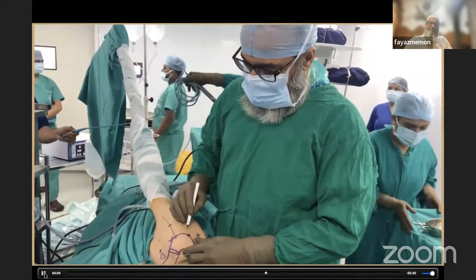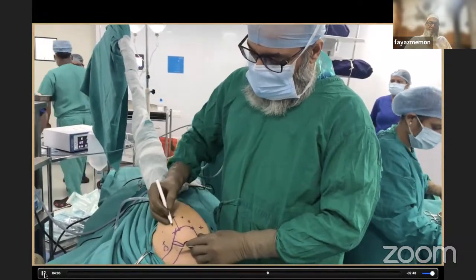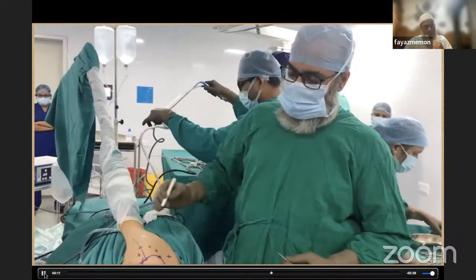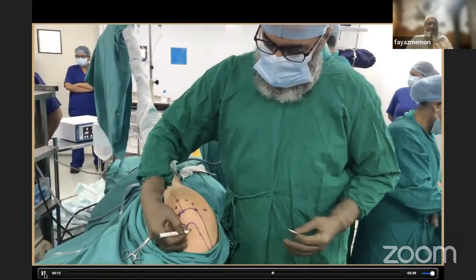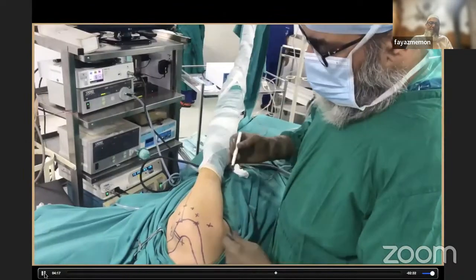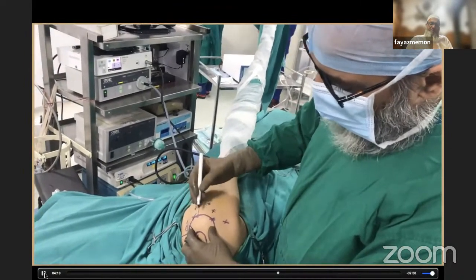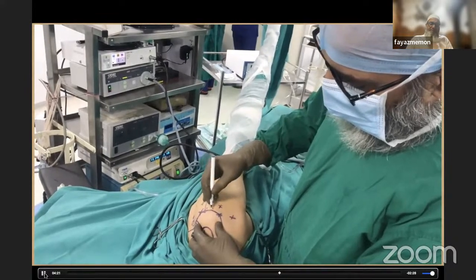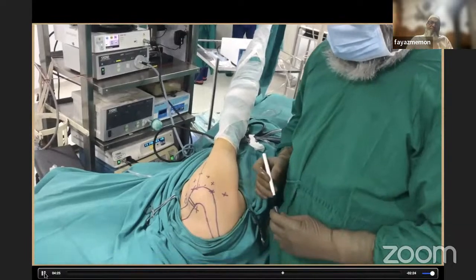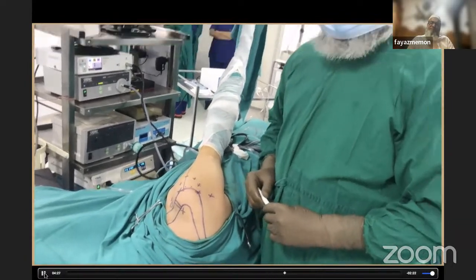So anterior, posterior, you can have as many portals over here. I'm just trying to simplify. And if at all you require, you can take a portal from here also, but that is rarely required. Along this surface of the acromion, you can have a couple of portals for the insertion of the anchor whenever you need for the rotator cuff surgery.